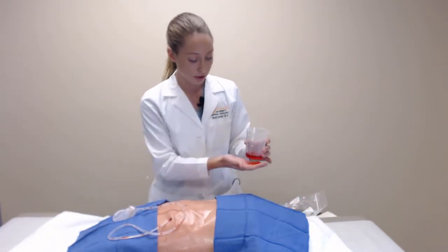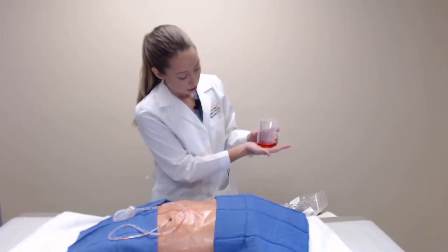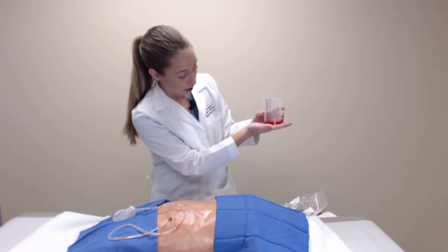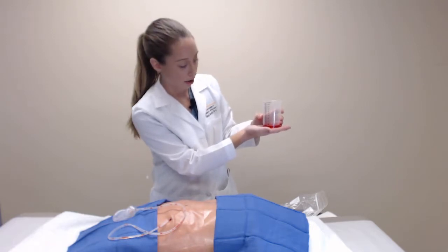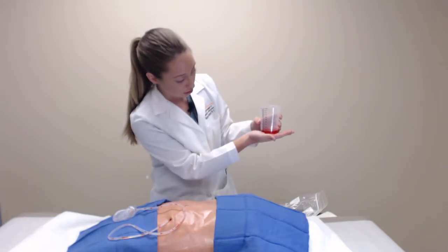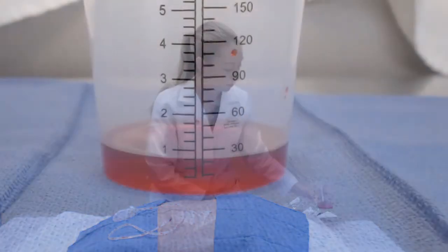To record the content of your drain, it's important to have it on a flat surface. You would look at the milliliter side of your drain and then record that amount on a log or a chart, whichever is provided by your physician. So for our example, our drain was at 20 milliliters.